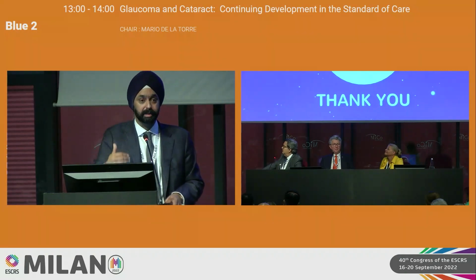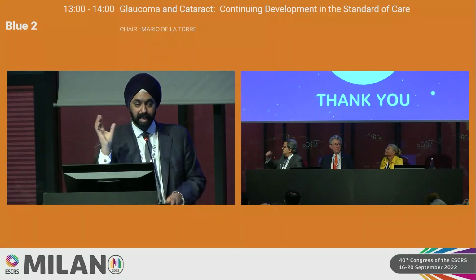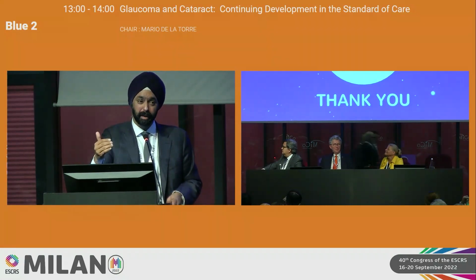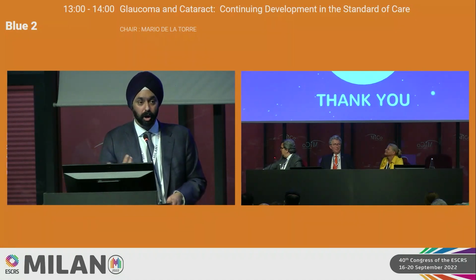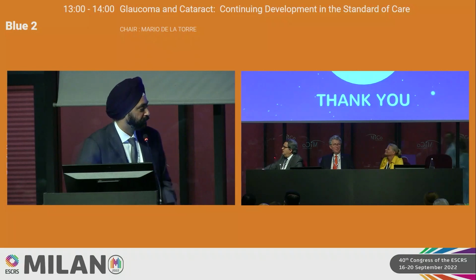Let's say you do your iStent, or you do your canal dilation, your goniotomy, and you still have some area of TM left over, but the pressures are not where you want them to be, and the patient's not happy going on drops. A great opportunity to say, let's try SLT to augment what I did with my MIGS procedure. Okay, there is no question.